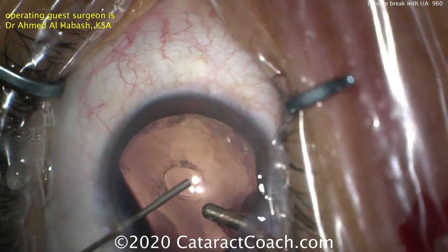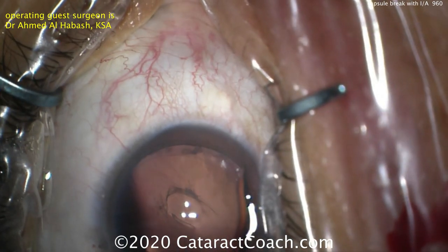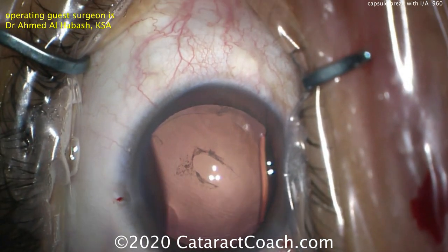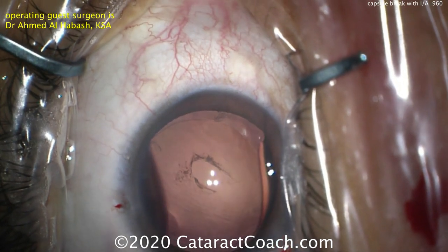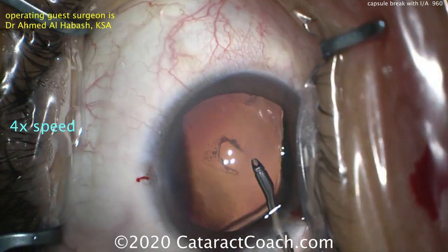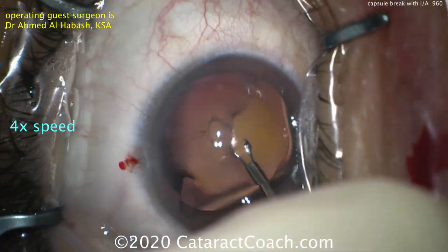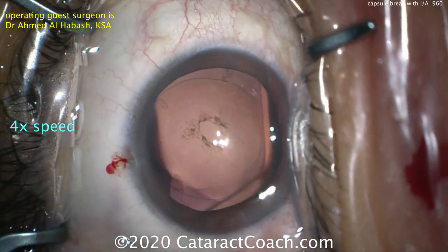Now we can come out of the eye with the instrumentation. The AC is still full of viscoelastic, the anterior hyaloid face is still intact, no vitreous prolapse. Now we're going to see Dr. Al-Habash create a posterior capsulorexis — taking this irregular shape of the posterior capsule opening and turning it into a round capsulorexis.